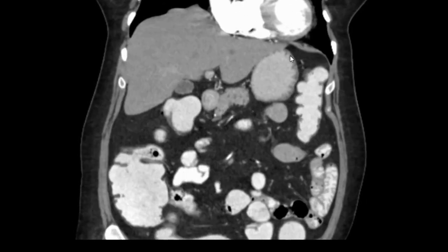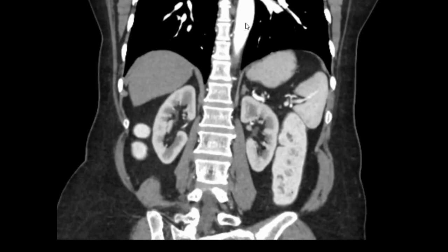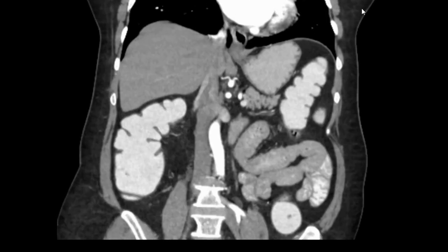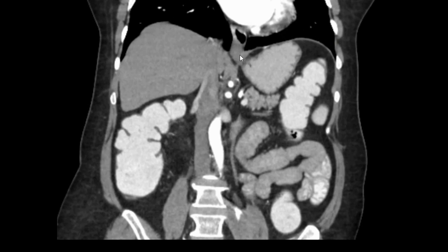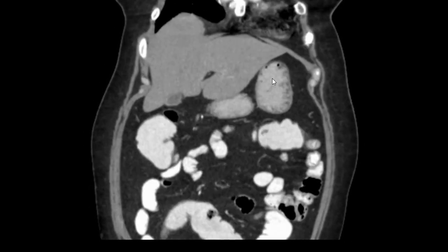So: liver and gallbladder. Now we saw the aorta — again this white structure, because this is an arterial phase image — this is the aorta. Anterior to the aorta you can see this air-filled structure which is the esophagus, and the esophagus opens into the stomach. This is why console scan reading is very important.